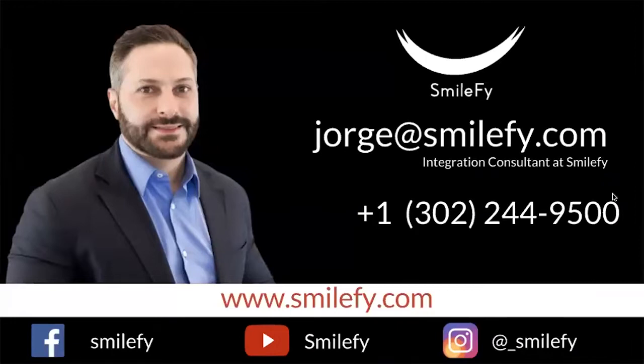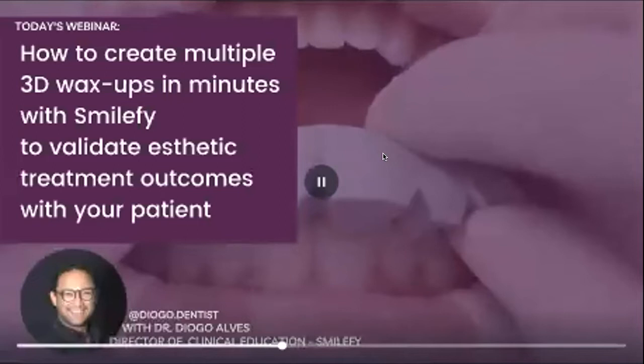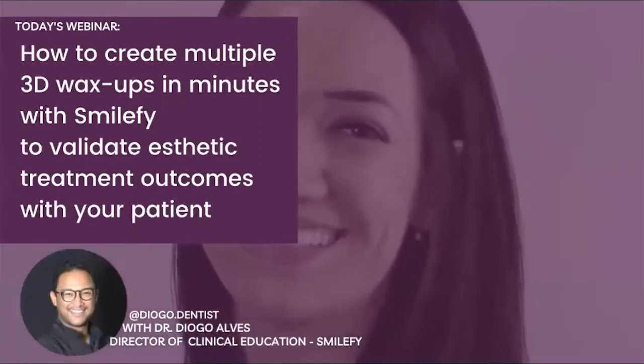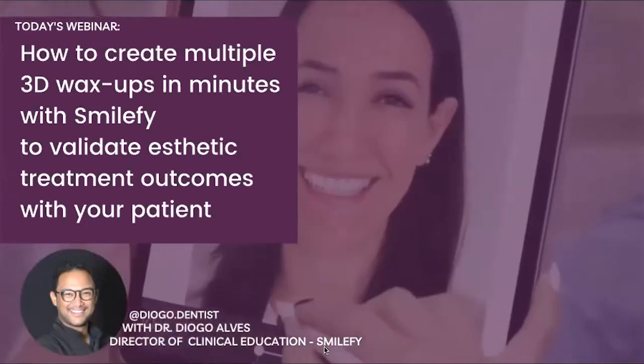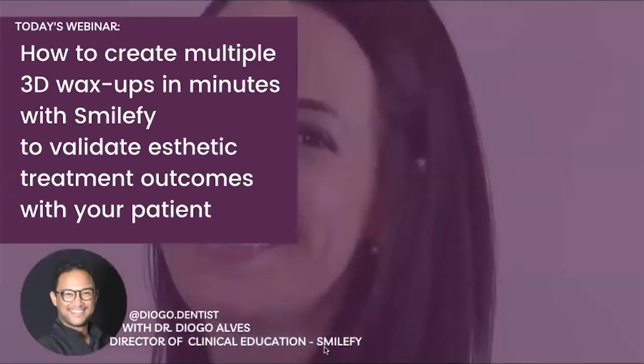Wonderful. Well, so if you are here today, it's because you also want to become a smile designer. You also want to enhance the way you do your consultations with your patients. And this is definitely what we are going to be discussing today. But before I get started, I want to know your specialty. So I have placed a poll. Select your option. That way I get to know you better.